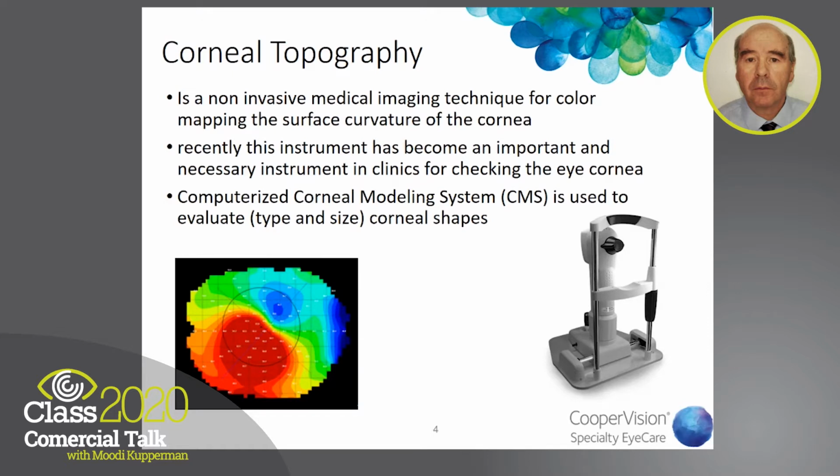With these measurements, we can have a lot of parameters in order to evaluate the best fitting for this irregular cornea.